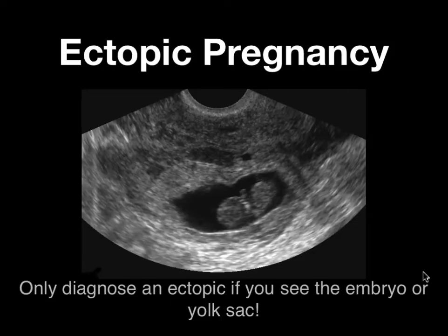Let's take a look now at ectopic pregnancy. Definitive diagnosis of an ectopic pregnancy requires that you visualize a yolk sac or embryo outside of the uterus.